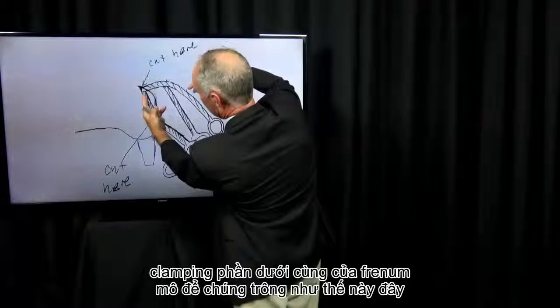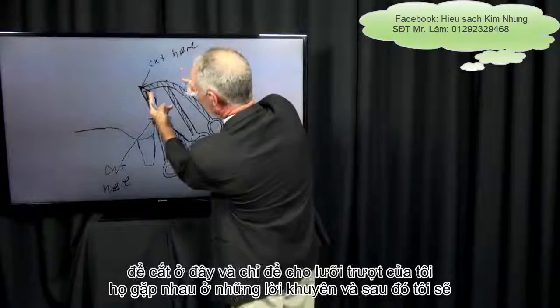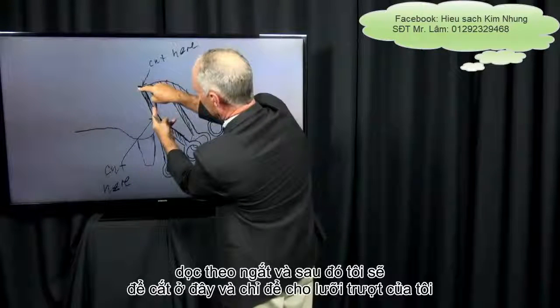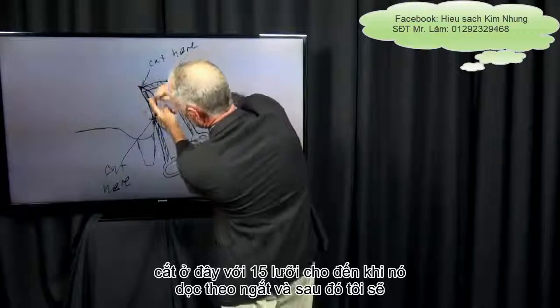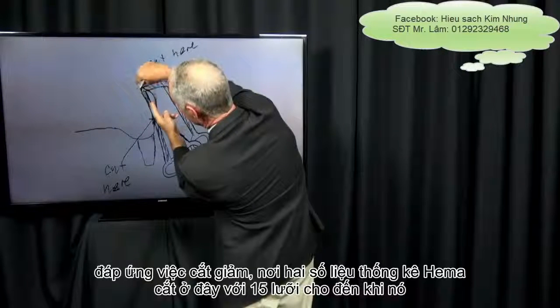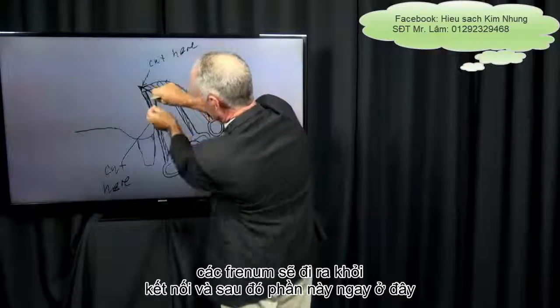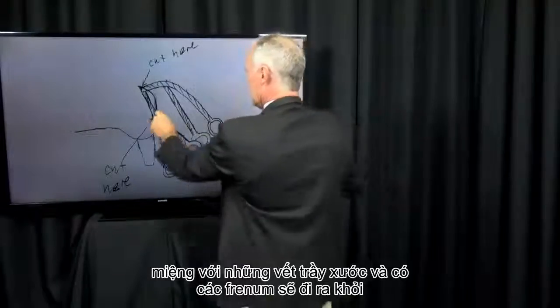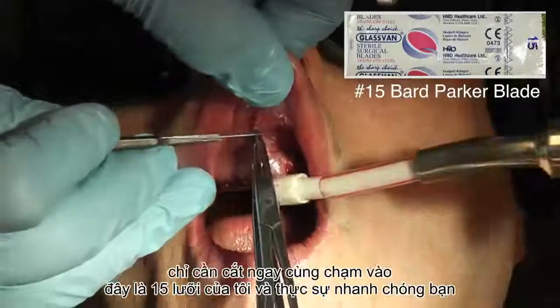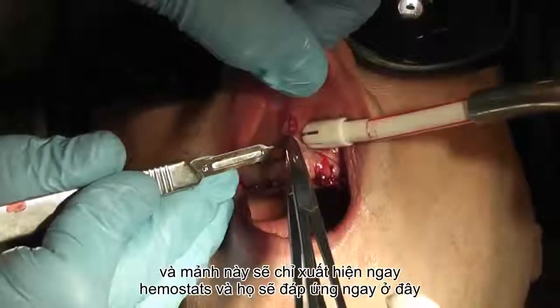This is clamping the bottom part of the frenum, and this is clamping the top part, and they meet at the tips. Then I'm going to cut here and just let my blade slide along the hemostat, and then I'm going to cut here with the 15 blade until it meets the cut where the two hemostats connect. Then this piece — the frenum — is going to come out of the mouth with the hemostats, and there's going to be a big hole in the tissue right there. You just cut right along, touching the hemostats, and they'll meet right here, and this piece will just come straight out.